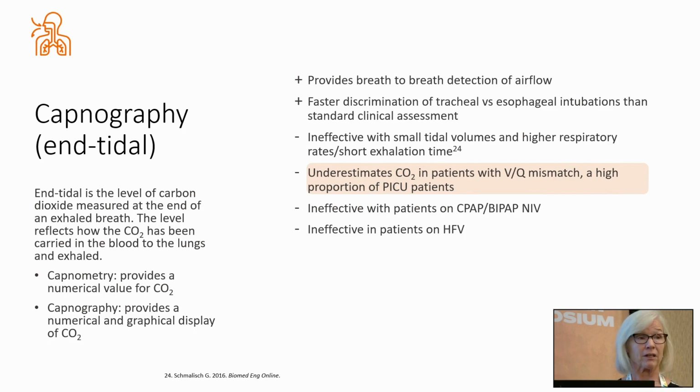Okay, capnography, end-tidal CO2, which seems like more of us are familiar with end-tidal CO2 technology. A lot of ventilators have it built right in, which is nice. I know it can be frustrating because it does add a little bit of dead space, which you're probably not so concerned about in the PICU in adults, but you are concerned about that in the NICU.